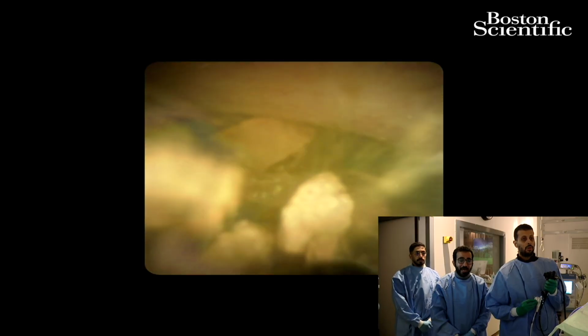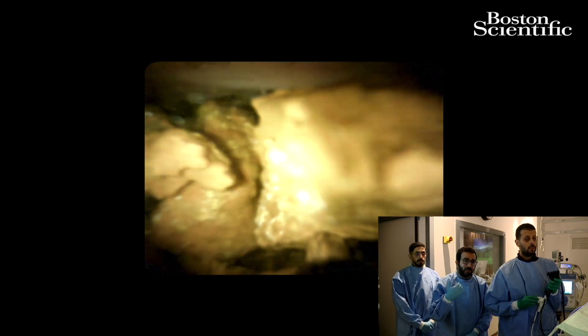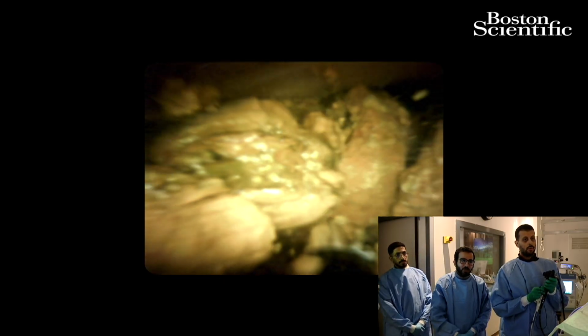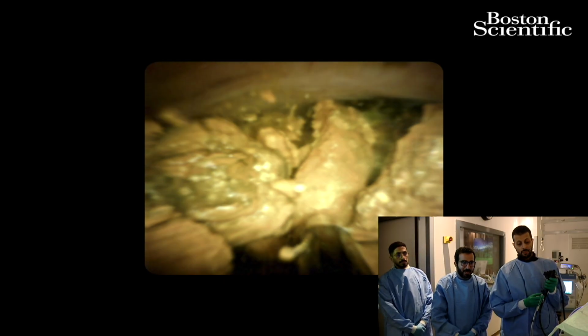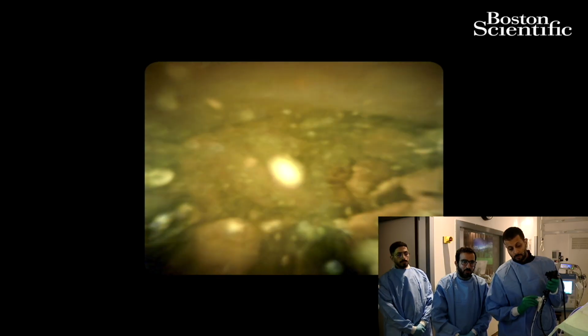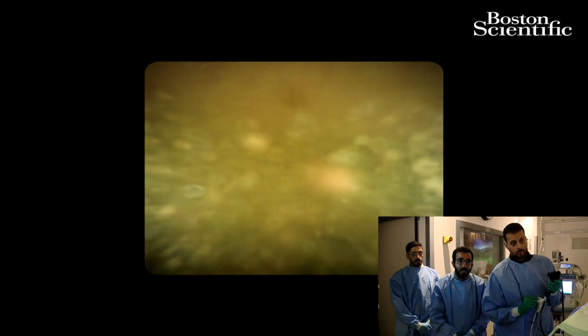Good. So positioning is one of the most important things, and also good visualization. Sometimes the bile duct wall looks like a stone, so you just keep crushing and you never know what's really behind the stone, especially a big one like this causing complete obstruction. We need to be careful with the pulses, and each time we deliver a shock pulse, we also put in water for good visualization to make sure that we are not touching the wall, especially the wall distal to the CBD.